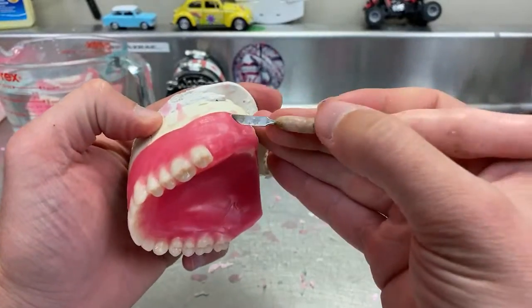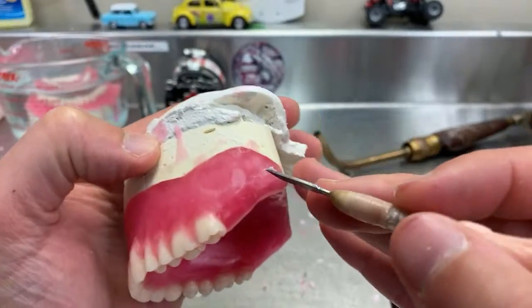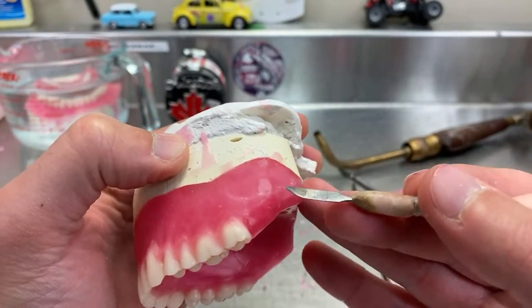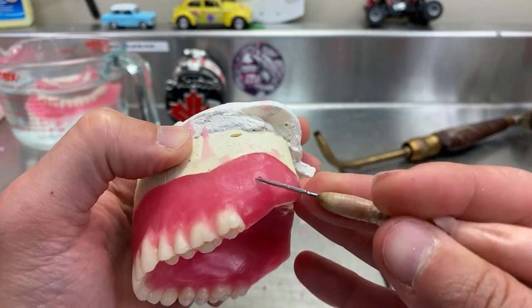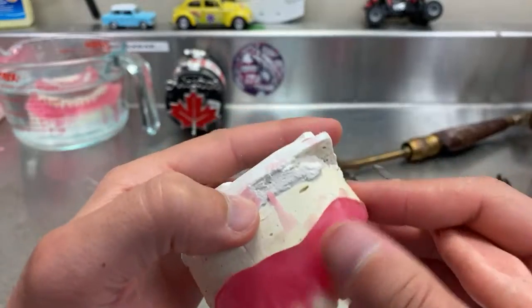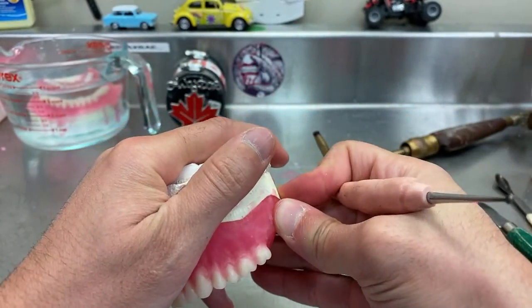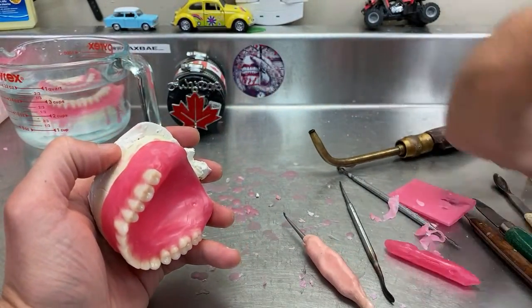Making sure there's nothing. See that here when I showed you the example? That's exactly what happened, delamination, because there is a cold surface and there's trapped air under it. And that's always a problem. I hate it, but right now it's okay because I did it on purpose. Actually, I can't look at it.